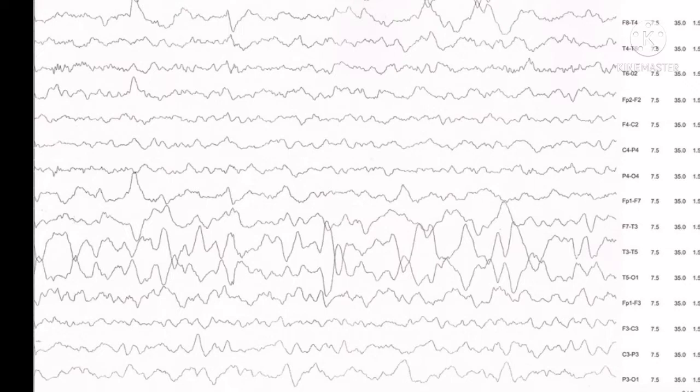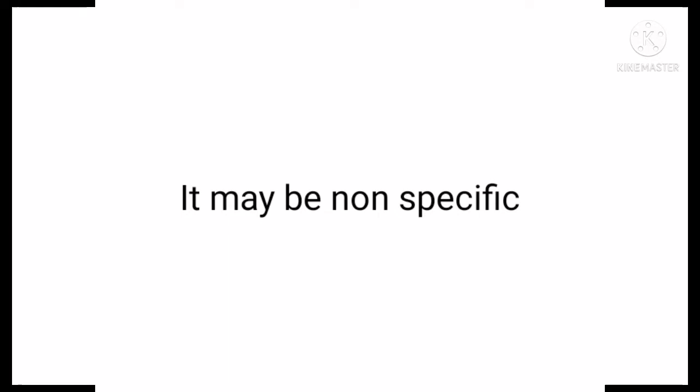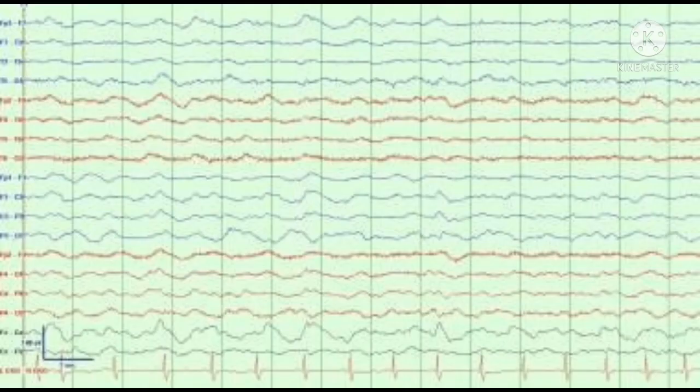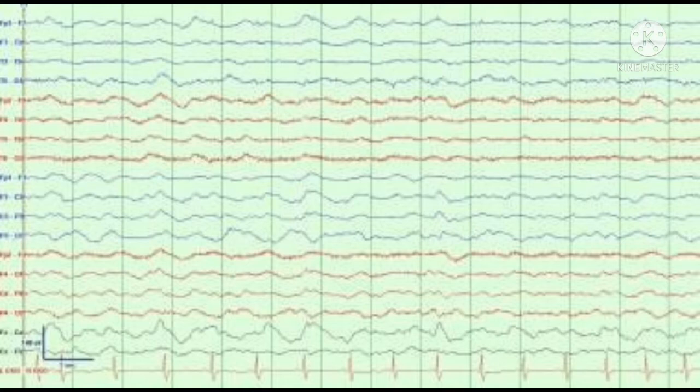When we have no focal spikes or sharp waves, it may be non-specific in that it can occur in the post-ictal state or complicated migraine. If we talk about generalized slowness, we have two types: either continuous diffuse slowing or intermittent slowing.